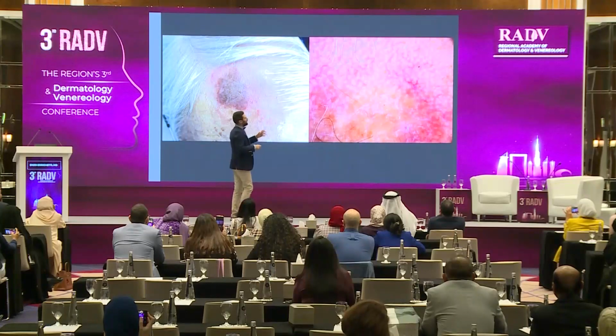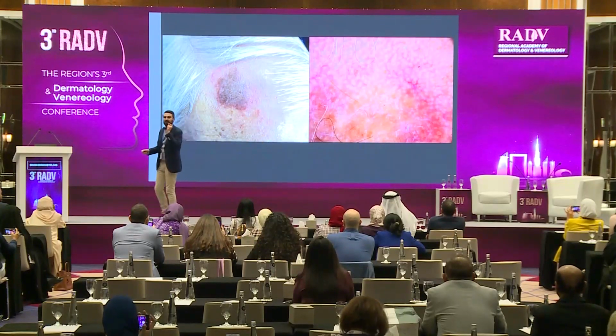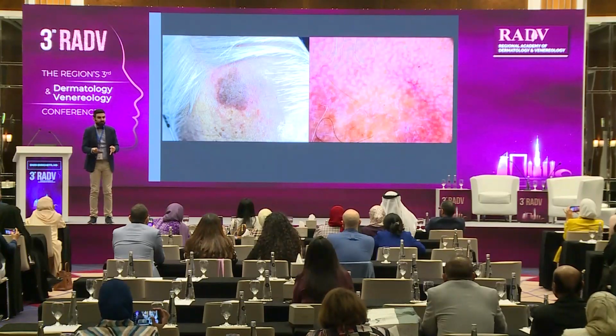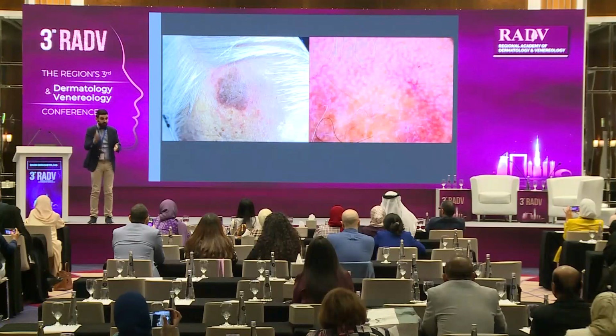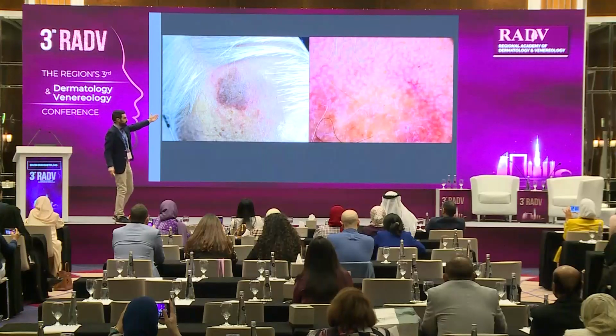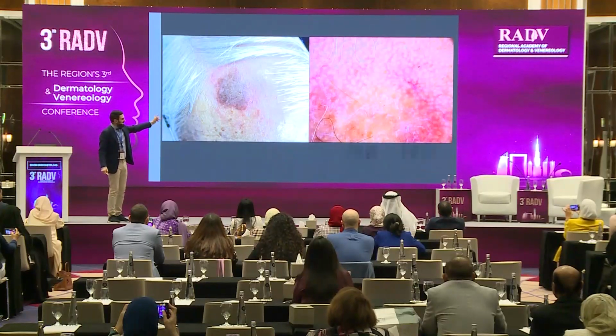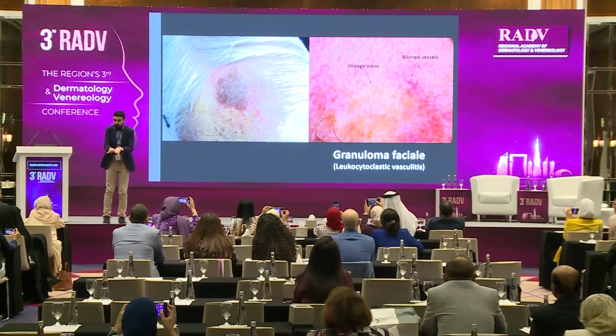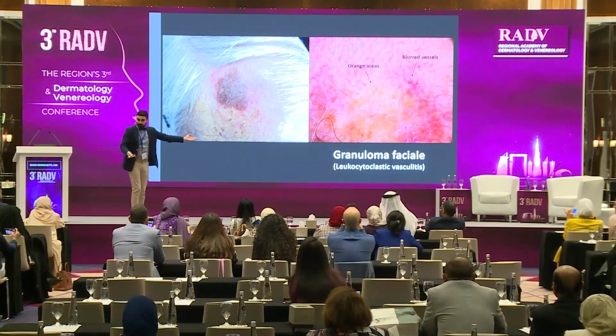We don't have relevant vessels, I'd say, just a little bit of unfocused vessels. And as I told you before, in granulomatous dermatosis, vessels are always focused, sharp, except for granuloma annulare, but this is not granuloma annulare, of course. This is granuloma faciale, which is not a granulomatous dermatosis, because what's this? Yeah, leukocytoclastic vasculitis, okay? So it's not a granulomatous condition.